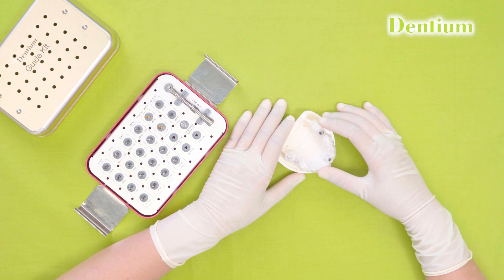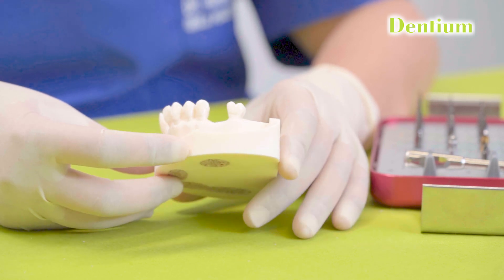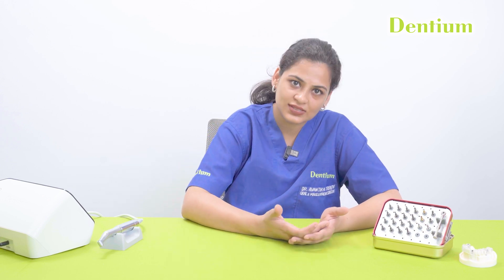After complete placement of the implant through the surgical guide, I will remove the surgical guide and check whether the implant is properly positioned. As I can see, the implant is nicely placed inside the bone, surrounded by bone throughout. The diameter of the final drill is the exact final diameter of the implant. If the coronal portion of the implant is still exposed due to good bone quality, you can over-prepare the osteotomy by drilling it twice with the final drill, or use a shorter 6 mm drill of the same diameter as a countersink drill.